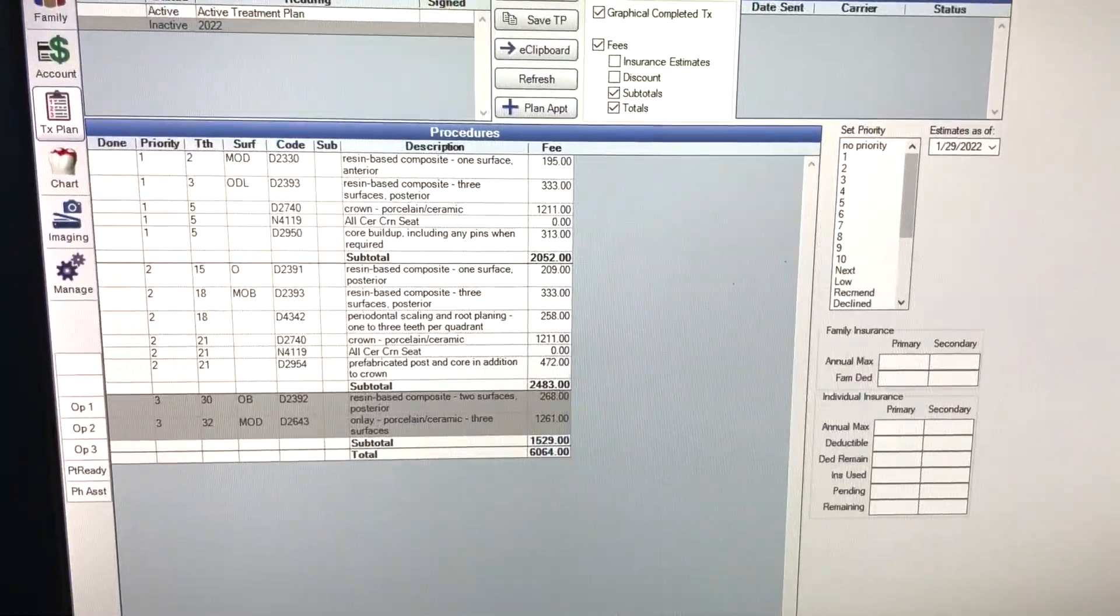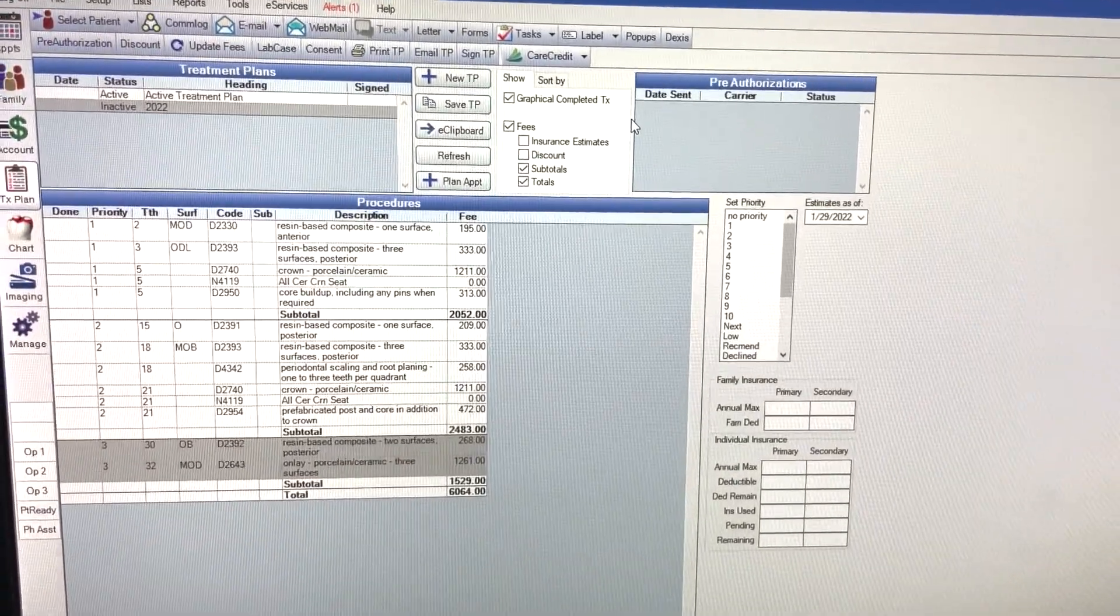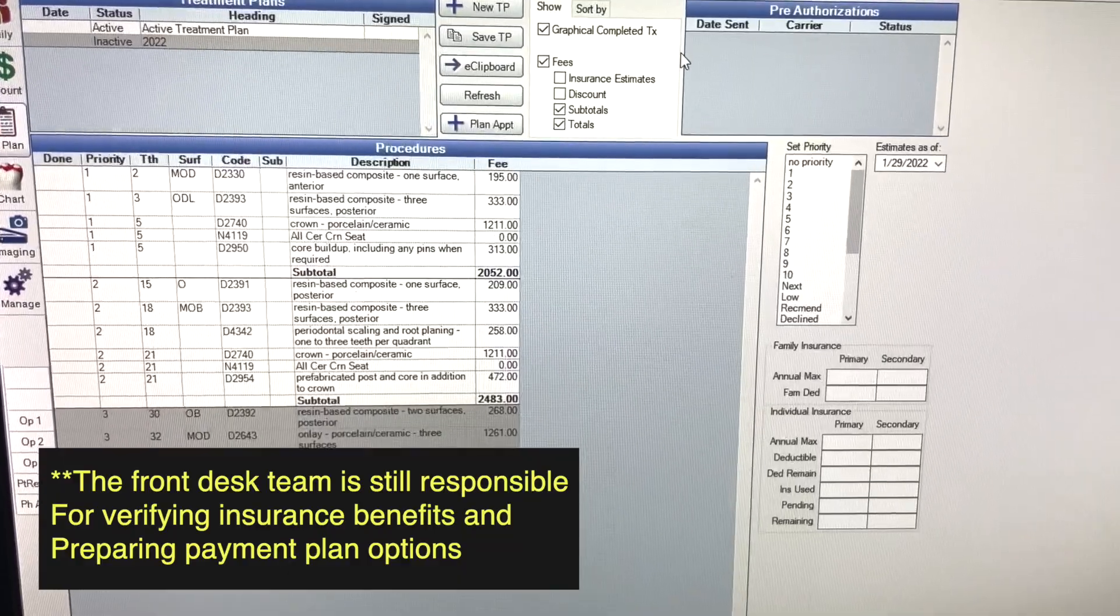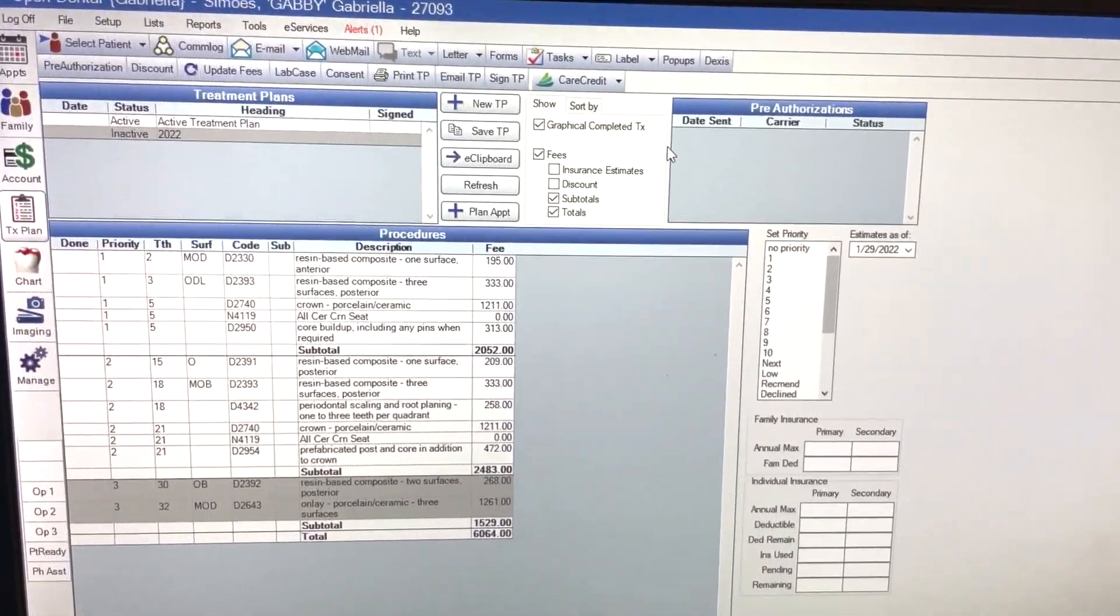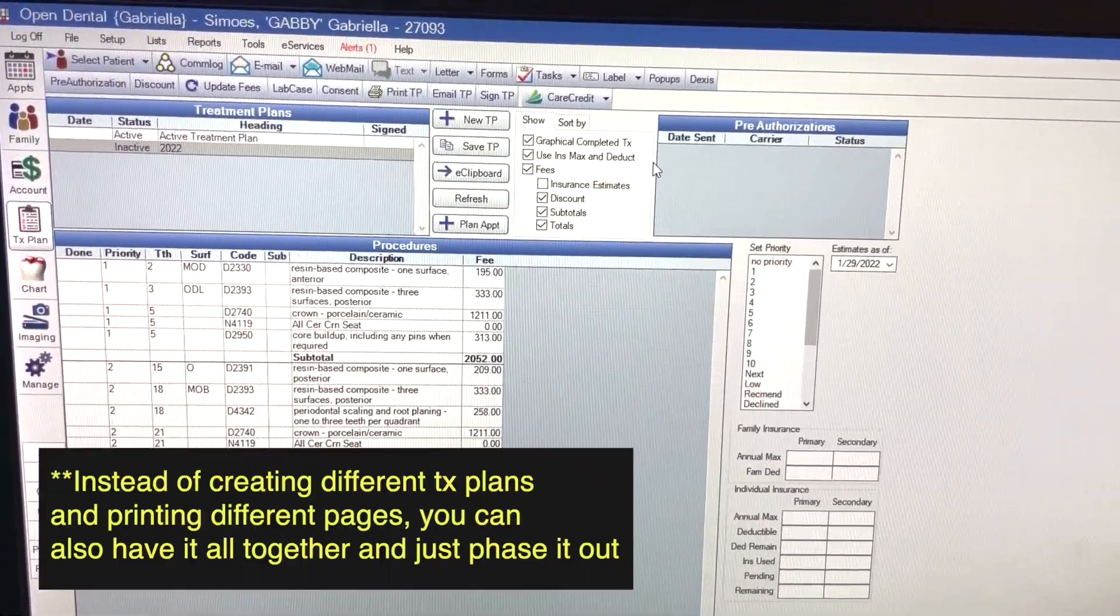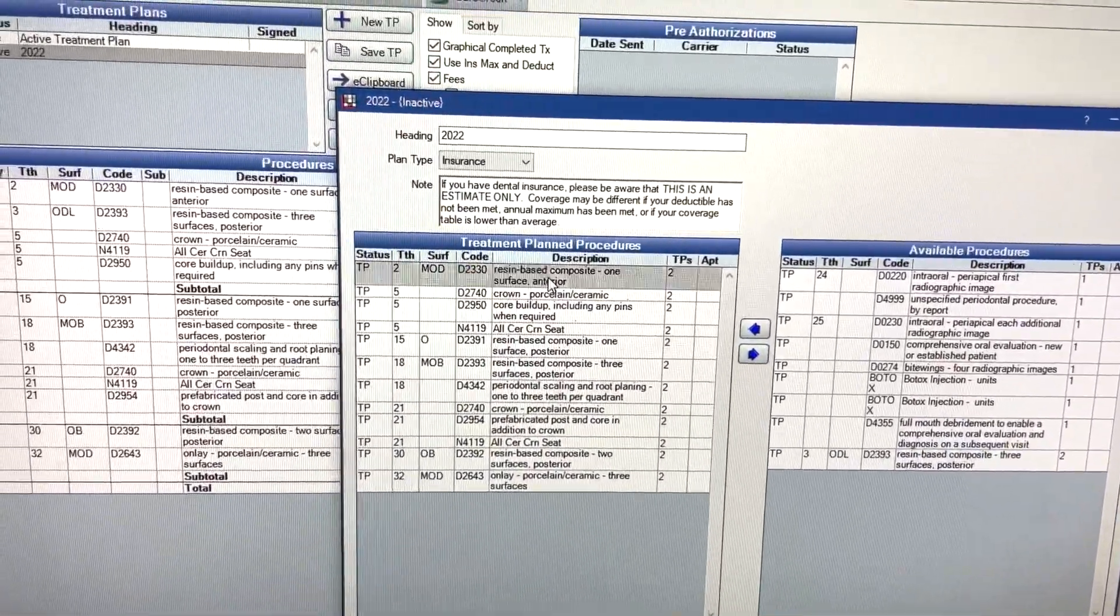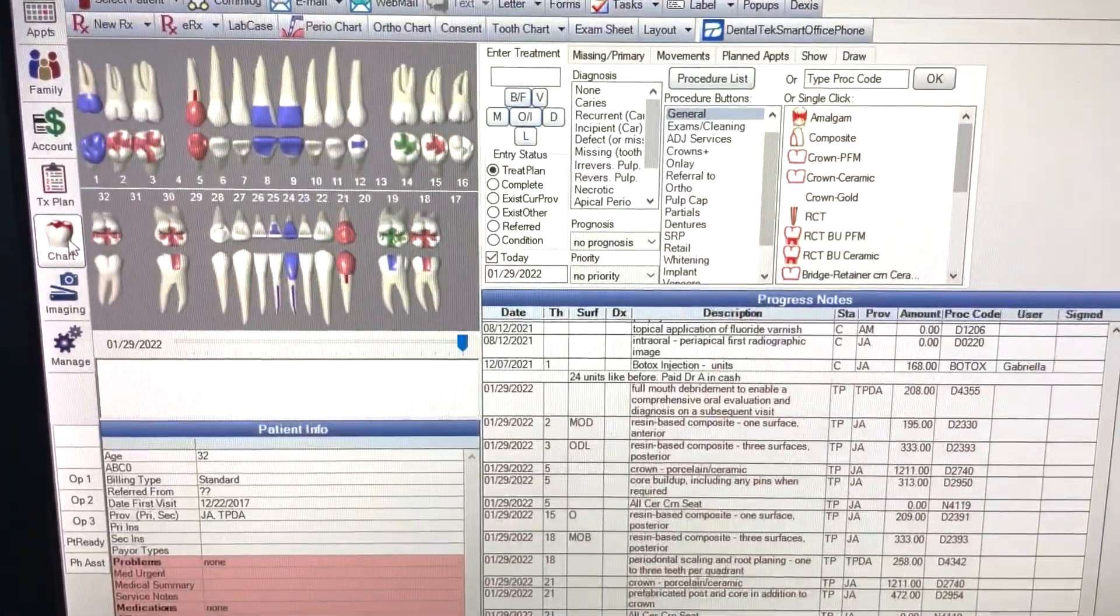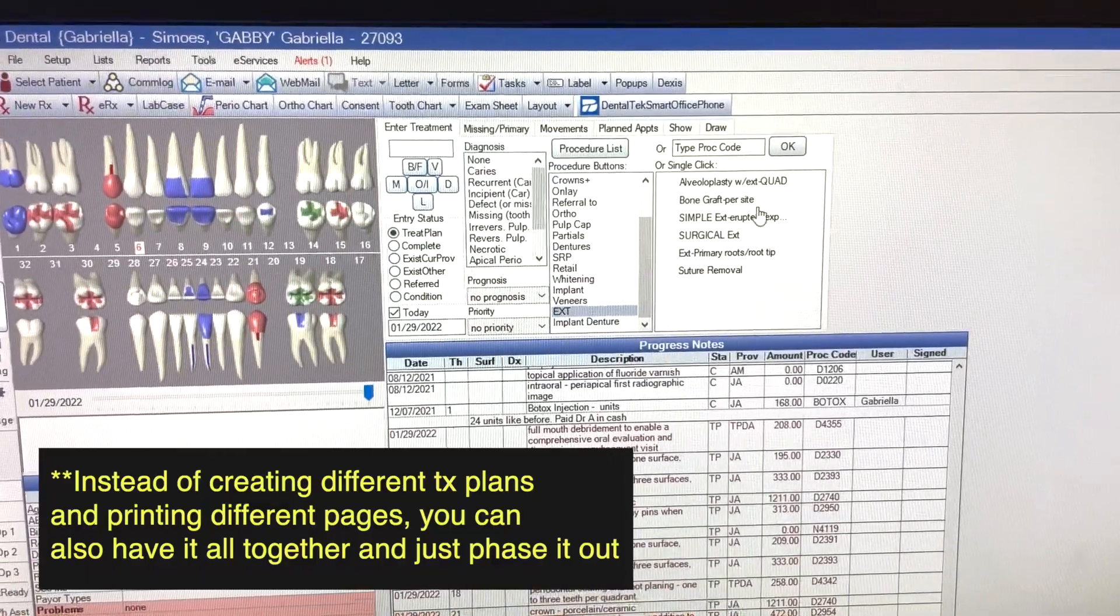So whenever you are done phasing it out, and this is why we say communication is so important between front and back, you can just go ahead and tell the front desk, hey, treatment plan is already in, everything is phased out. The only thing they have to double check is if the insurance fees are correct and the patient is gonna max out, all that financial stuff they will be in charge of. But at least whenever they see the phases they know what to schedule the patient and how we want to phase this out. Also, if you need to modify anything in the treatment plan you don't have to just make a whole new treatment plan. You could just double click on your treatment plan, a thing will pop up, and then you can take off something, you can add something.